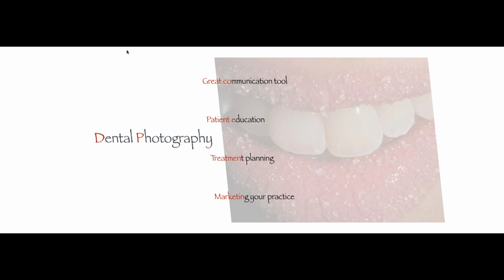Through dental photography, you can show your patients, you can show other colleagues, you can communicate with your periodontist, your orthodontist, the oral surgeon, and team members. You can also communicate with other patients, to show what you do and what they should expect as a result of your own work. So that's a key element in dental photography.